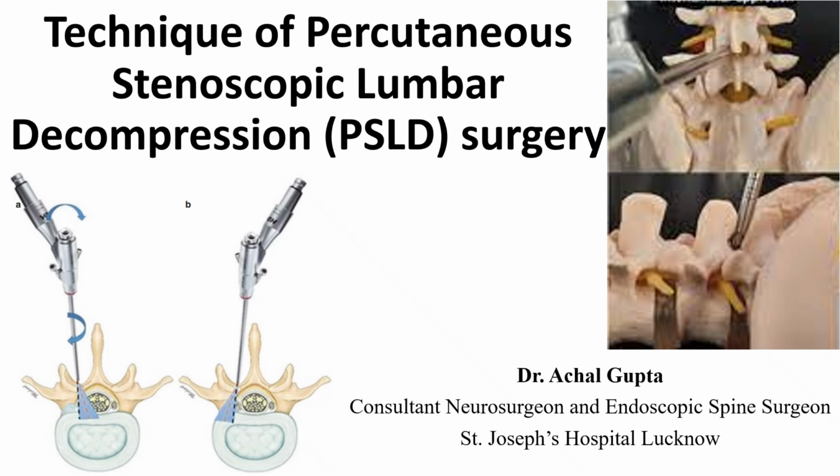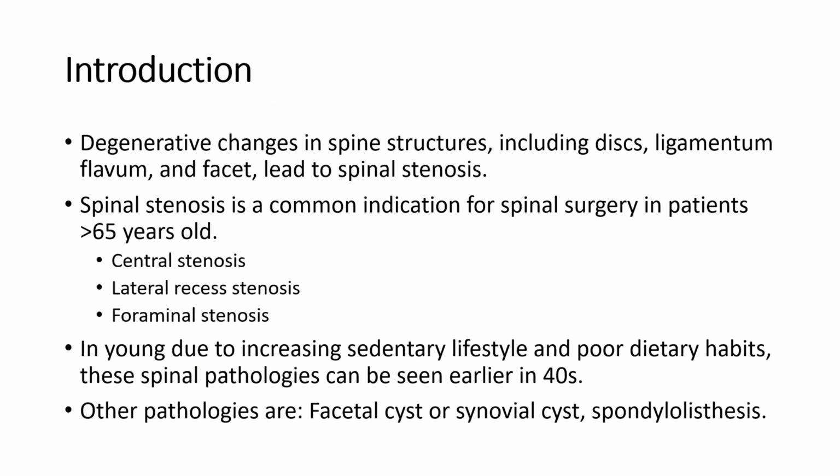Good morning, everyone. So today we'll discuss percutaneous stenoscopic lumbar decompression surgery, technical tips and tricks. Introduction. Degenerative changes in the spine structures including the disc, ligamentum flavum and the facets lead to spinal stenosis.